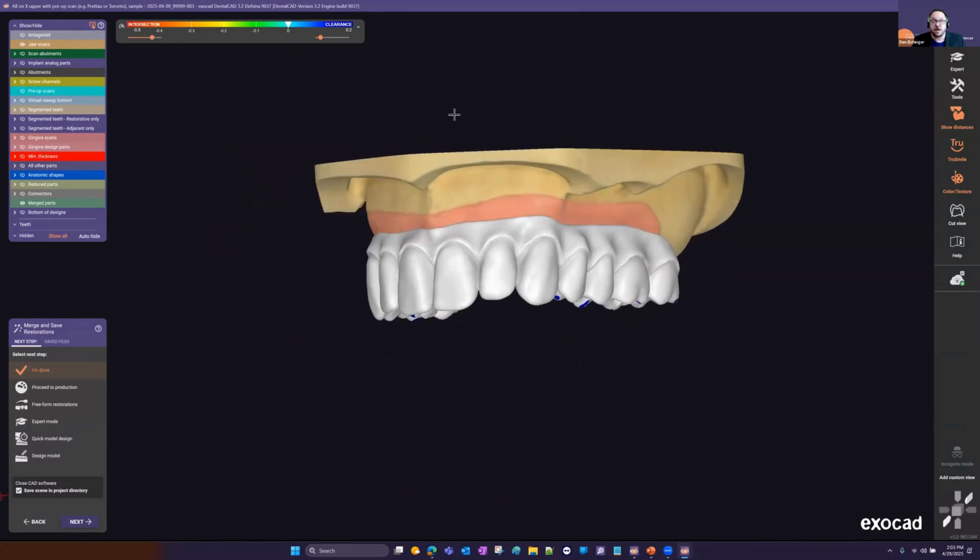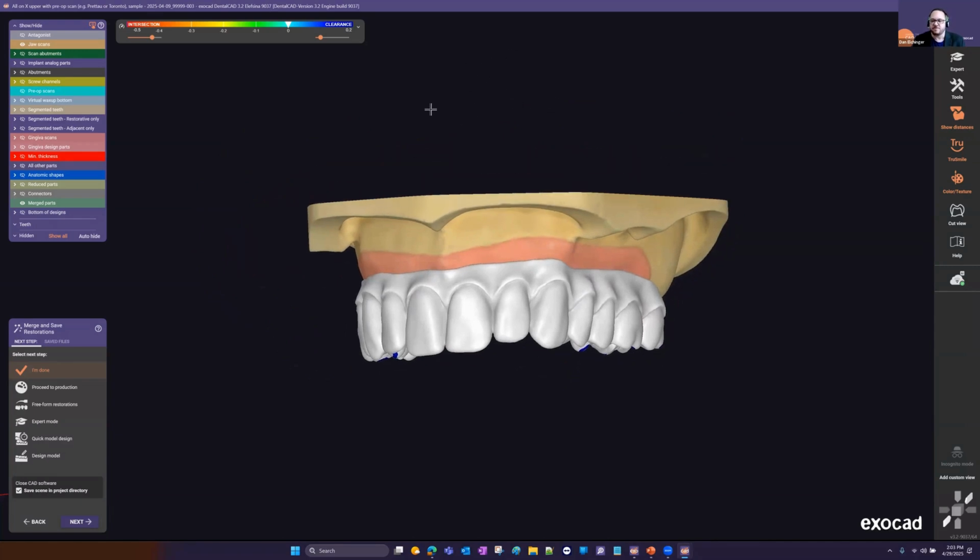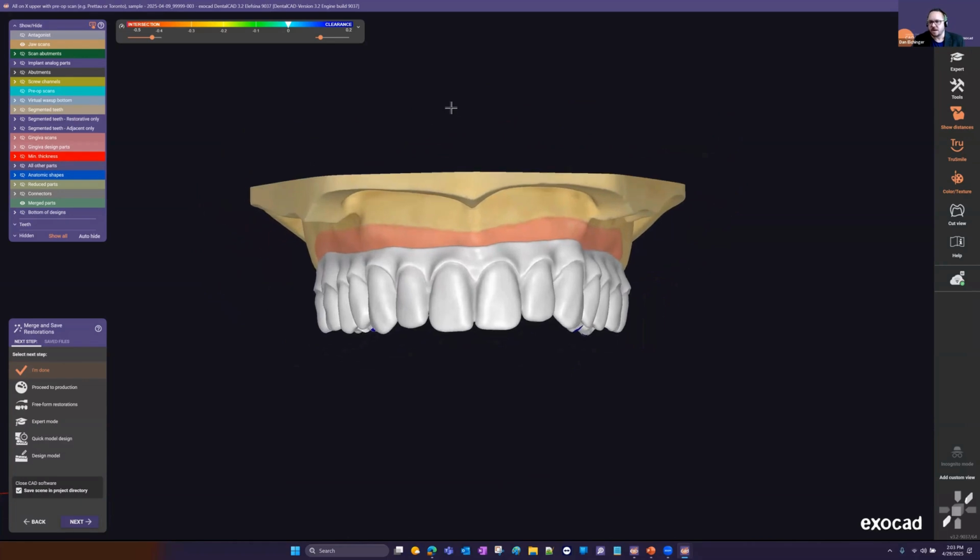So I'm drawing a blank. Is it the .3oxz files? I might be butchering that, but those 3Shape Communicate files import in automatically. You can set that up.